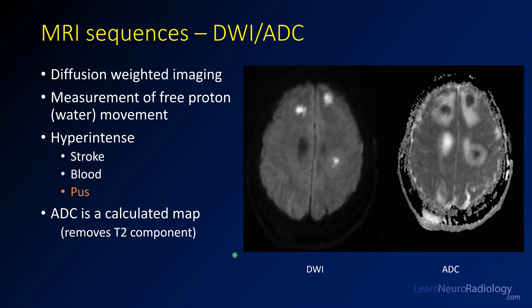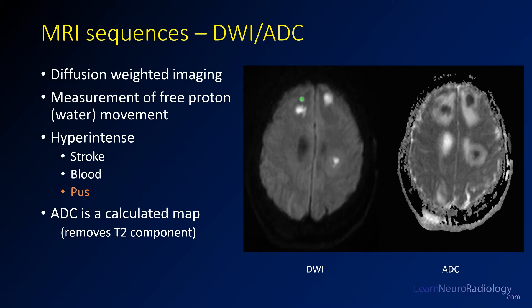MRI has a number of sequences which might help you. The first one to think about is diffusion weighted imaging, or DWI. DWI is a measure of free proton movement in tissue. Areas with restricted proton movement appear bright on DWI, and the corollary image, the ADC, is the calculated map where areas of truly reduced diffusion are dark. Here you can see several areas of reduced diffusion scattered throughout the brain — bright on DWI and dark on ADC. The differential for this is stroke, blood products, or pus. In the context of infection, we're thinking about pus, so a bright loculated lesion like this one is an abscess.